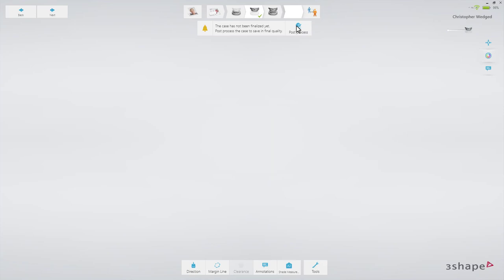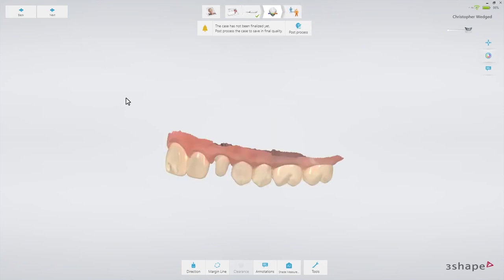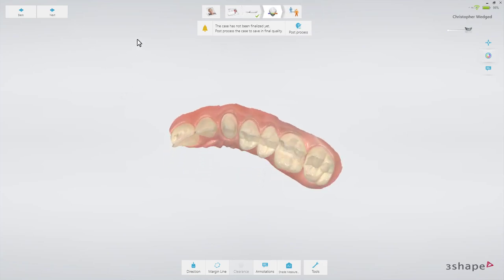Once on the analyze page, you can examine the scan and set the margin line, serving as guidance for the technician.